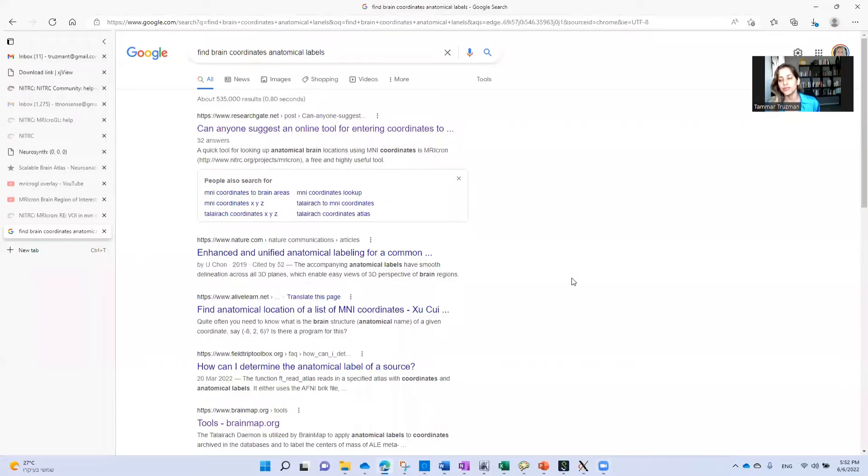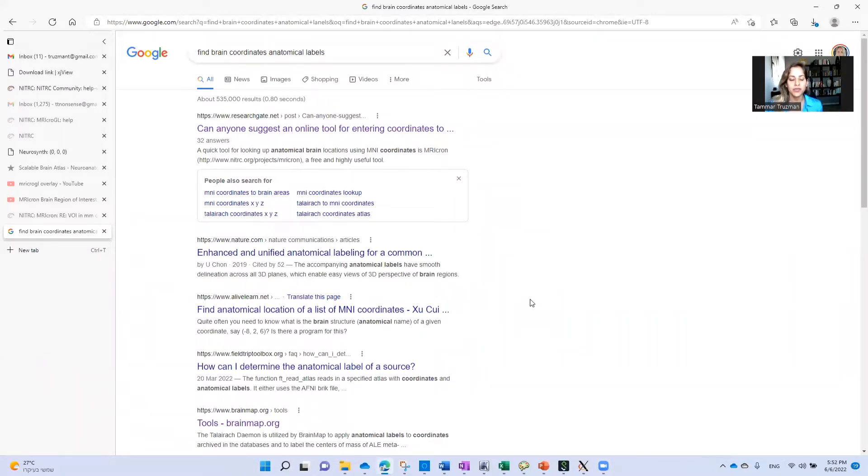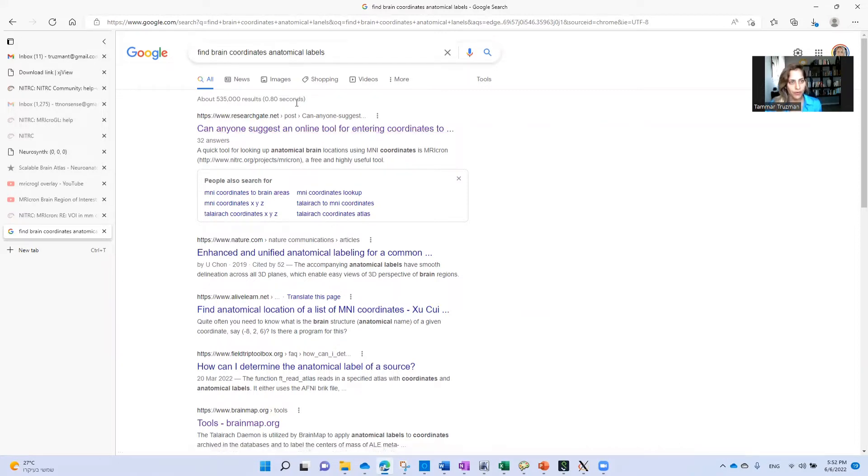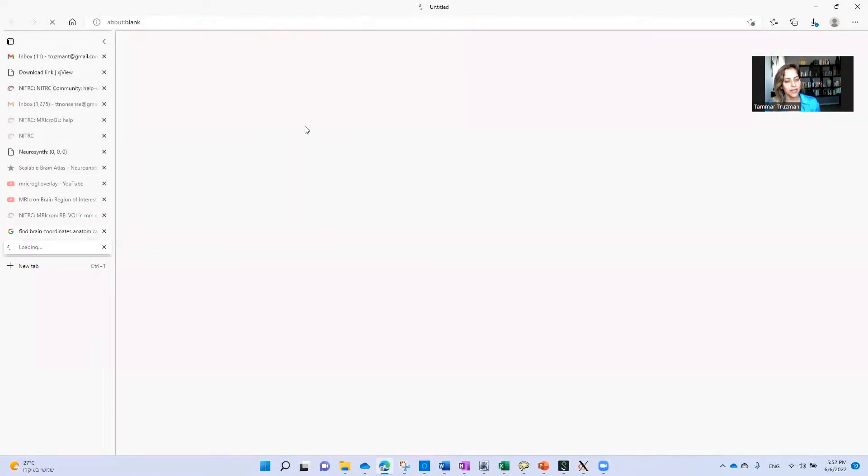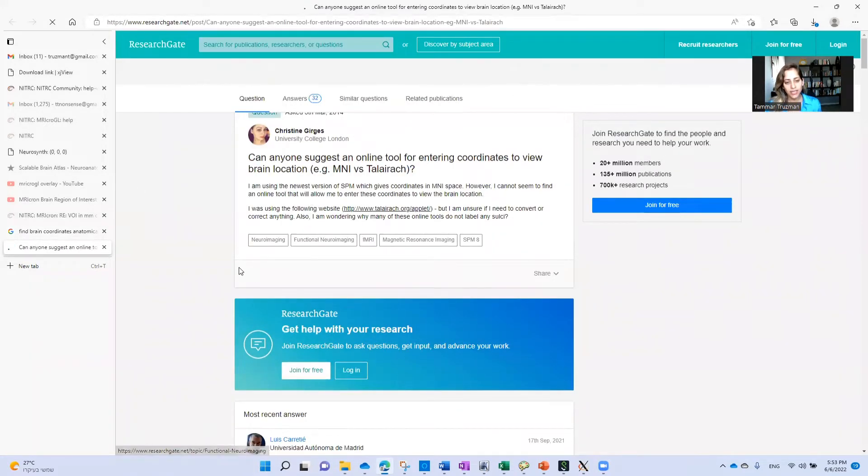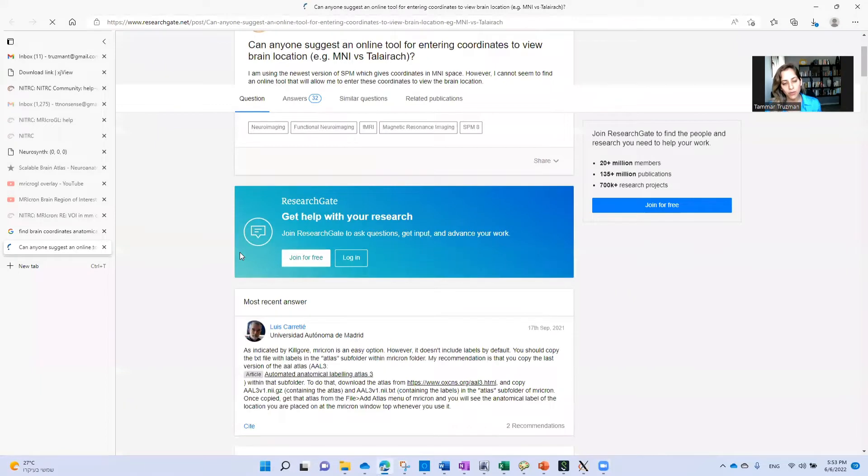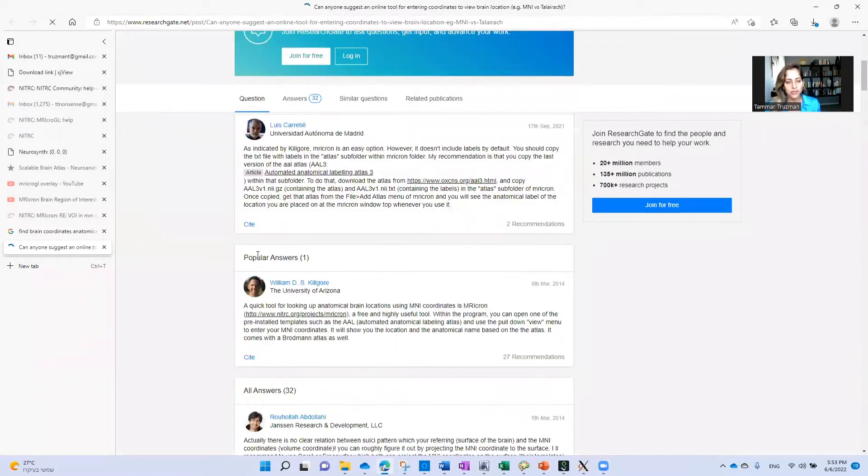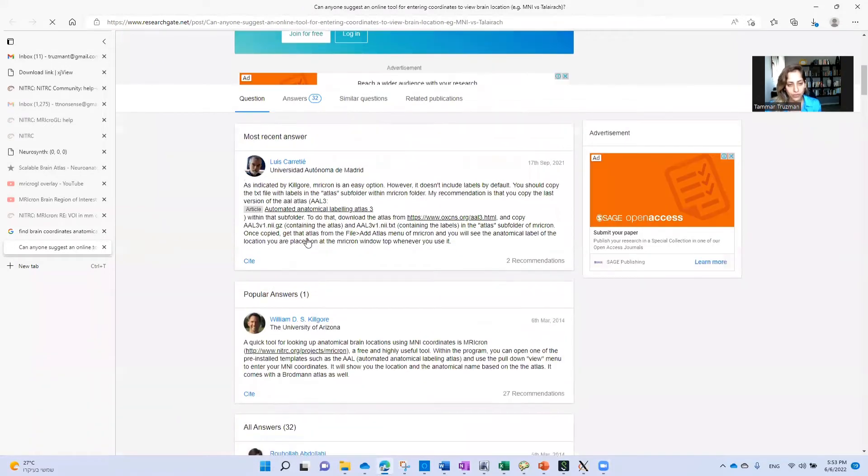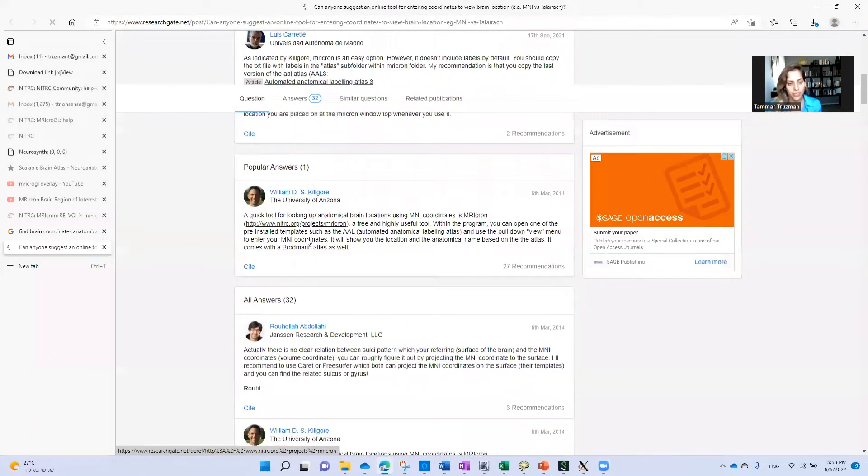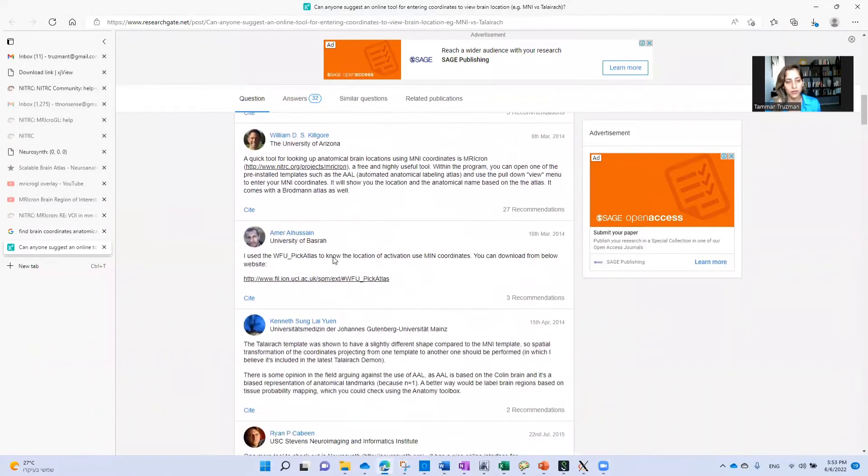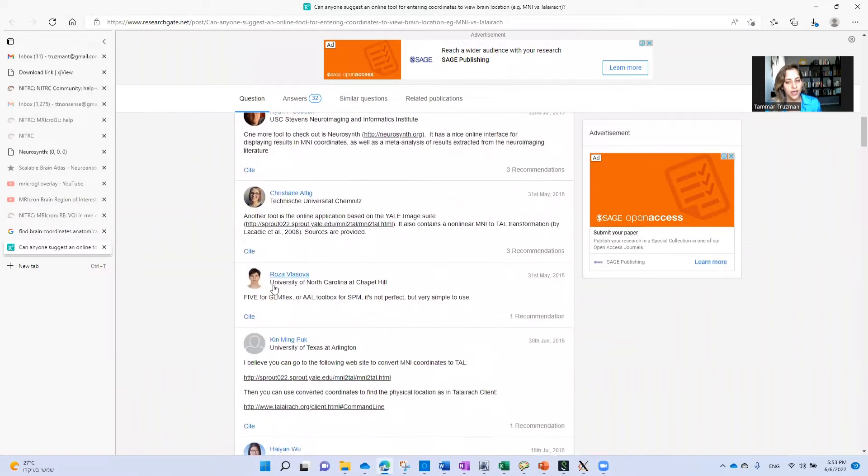Hi there again. This is a short video showing how to find anatomical regions or anatomical labels of brain coordinates. There are many tools available. For example, I typed this in Google and found in ResearchGate this question asked by Christine, and many people answered suggesting many tools to find anatomical labels for brain coordinates.